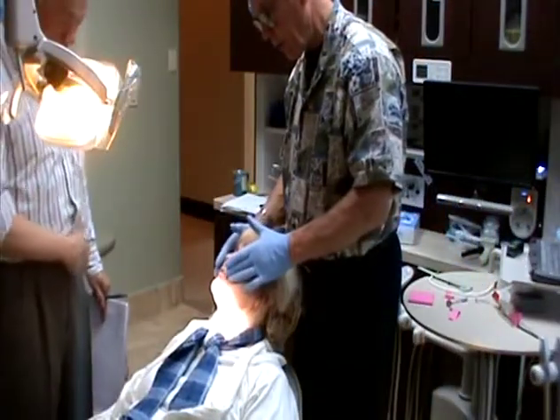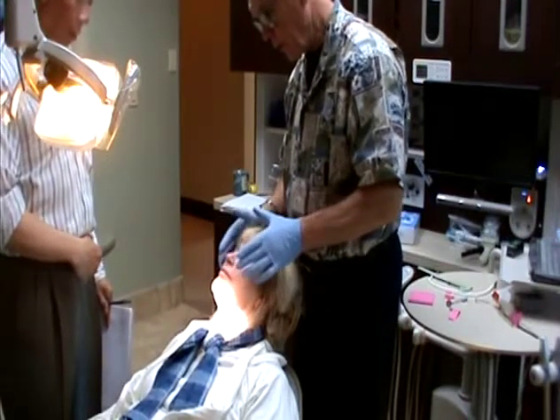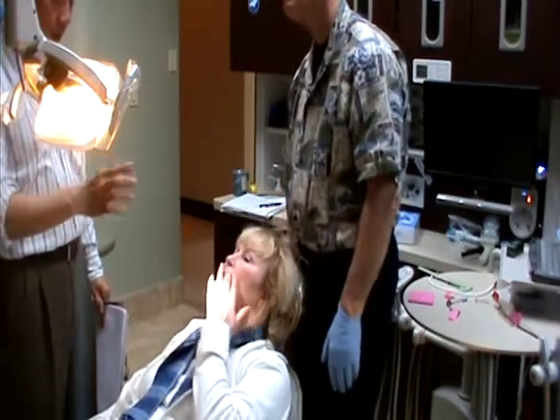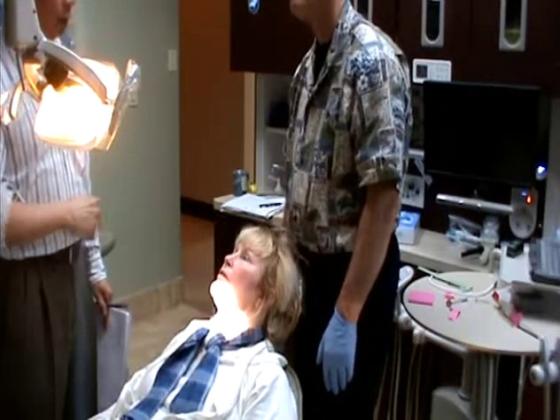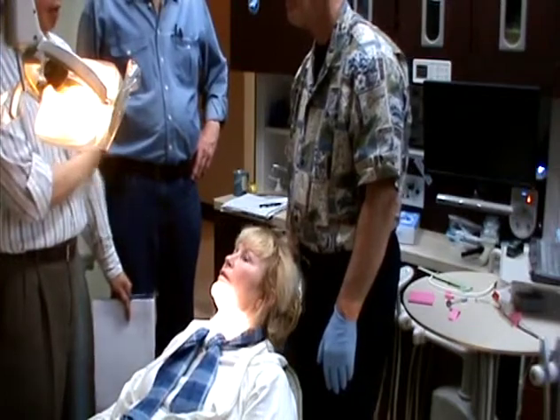You can look at her cheek. This one's like this, and this one's more low. She's just pushed in right there. Yeah, I can see it on my lip. You want to use asymmetrical expansion with the LF to get that freed up, right? Because there's no other way to do this that I know of, do you?